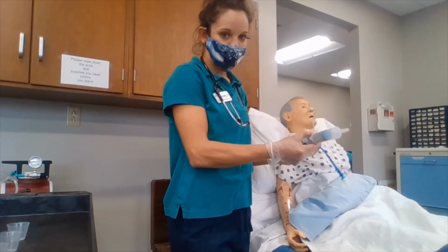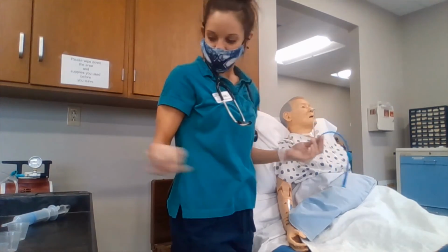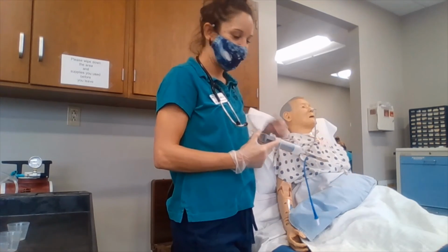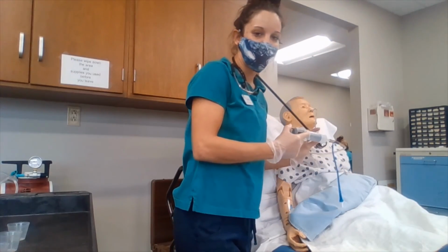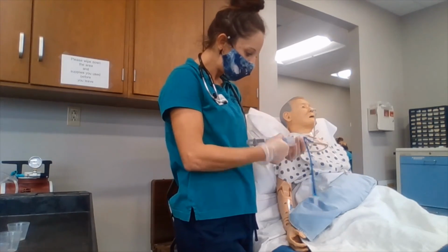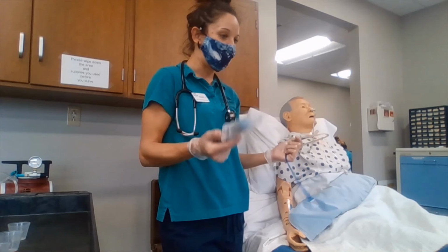We can also auscultate using our stethoscope and putting air through the tubing and listening with our stethoscope in the abdomen and listening to the whoosh sound. We will also be checking for residual volume.